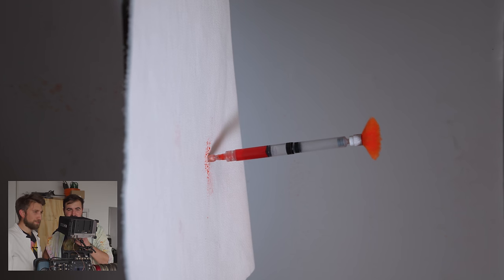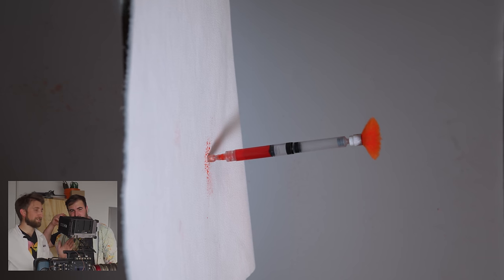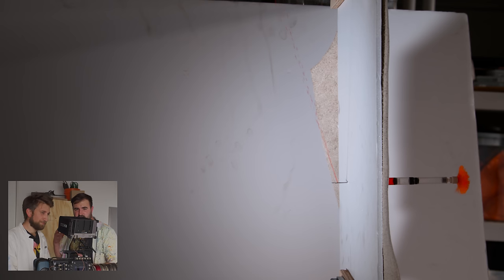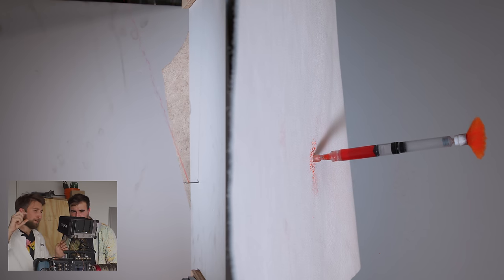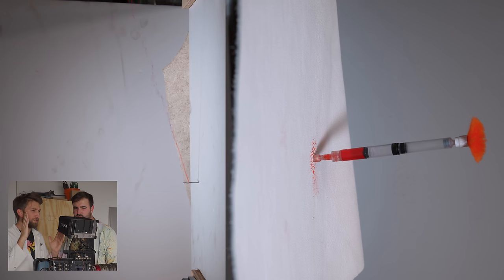That is 40 times slower than real time, and even still it's like — hello! This is from the back. Look at that, it's just spewing. It's really forceful as well. I guess because if the animal is moving or it's an active animal, they want to get that injected as quickly as possible so it doesn't have a chance to knock it off. And also it's a factor of the fact that it's quite a wide cylinder containing the liquid being forced through the skinniest needle and the smallest hole — even a tiny amount of force would just eject that for miles.